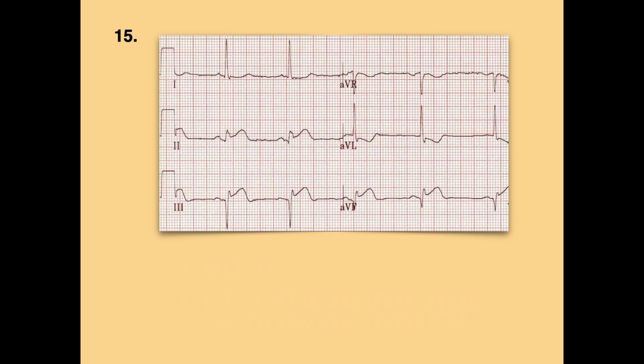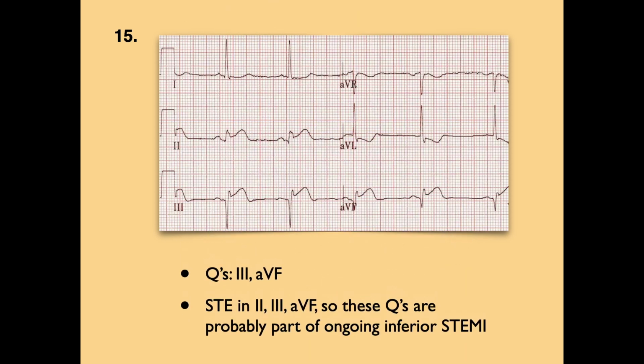Even though you said your second time round there was ST elevation in 2, which I agree with, your first time around you said there's not. I just want to point out, if you take your straight edge and lay it along the isoelectric line, I think there's about 1 there. So you don't need it because you've got this and this, but I'm just being picky here. Oh, in fact, yeah, okay, there we go.